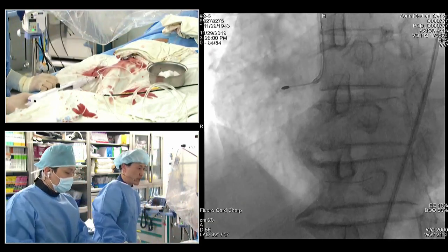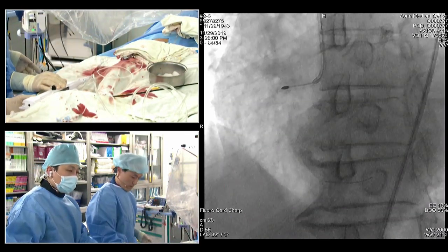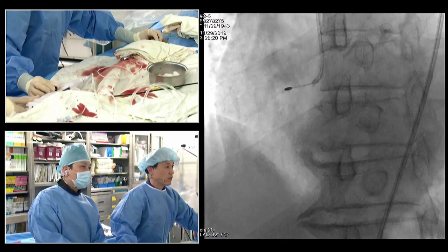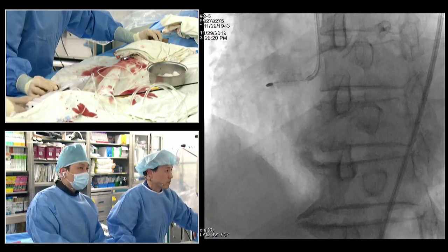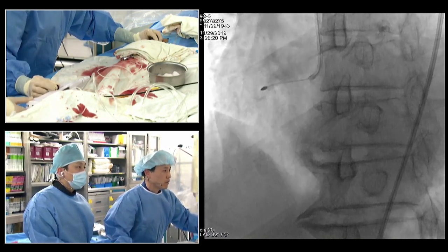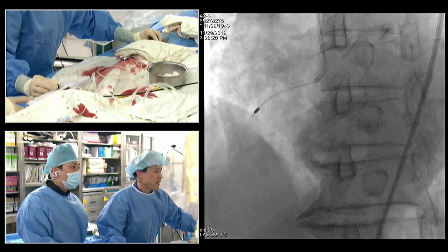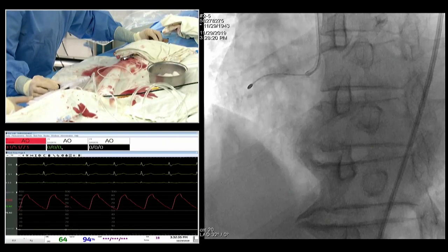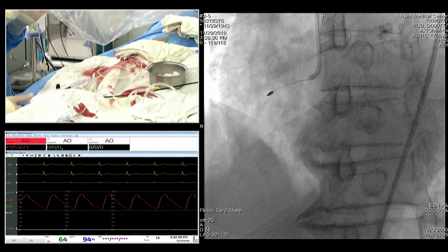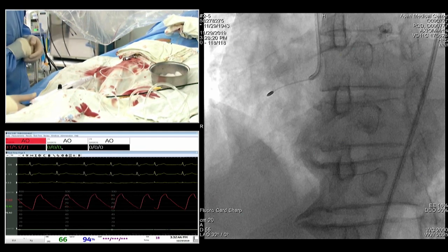So I'm going to go up Dyna. We're going to go at 150,000 RPM. Brake is on. Saline flushes. Ready? Yes, saline flush ready. Here we go. 1.75 per side. Okay, some resistance right here. Be very careful. I don't want this thing to jump. Let's give him a break. Okay, good. His heart rate's great. We don't have a pacemaker. I think so long as you minimize your passes, the risk of any hemodynamic or electrical instabilities should be okay.